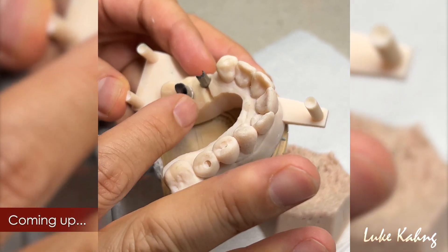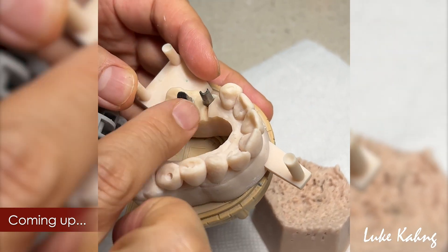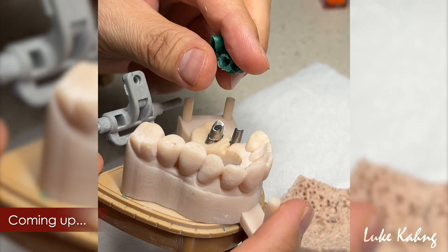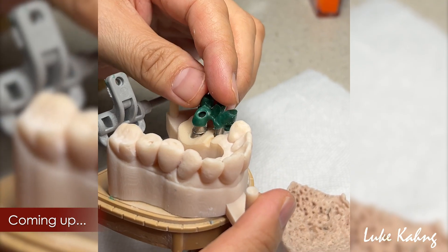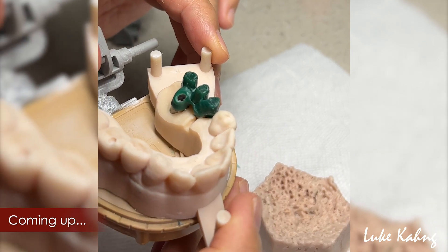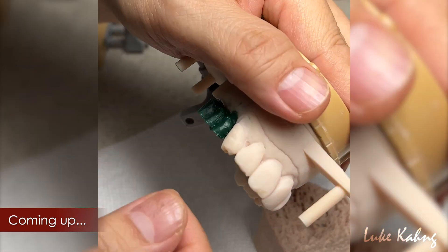The problem is implant positions are all the way lingual. Class 3, and we made a great abutment. We're going to cement the top after we fabricated the framework. And after this, I have to make the top of the zirconium.